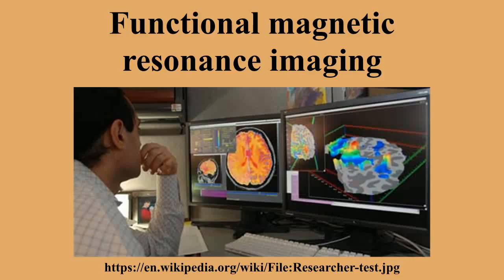Overview. The fMRI concept builds on the earlier MRI scanning technology and the discovery of properties of oxygen-rich blood. MRI brain scans use a strong, permanent, static magnetic field to align nuclei in the brain region being studied. Another magnetic field, the gradient field, is then applied to spatially locate different nuclei. Finally, a radio frequency pulse is played to kick the nuclei to higher magnetization levels, with the effect now depending on where they are located.